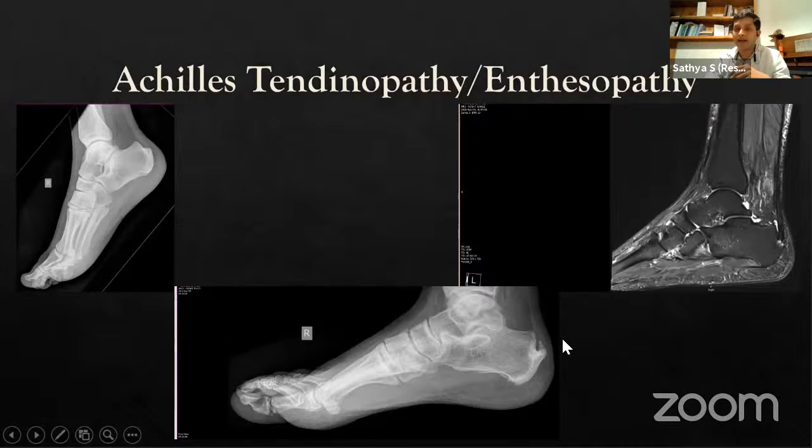However, he had an X-ray taken in January this year, and we are able to see the enthesopathy forming, and the retrocalcaneal bursa was present, and the bursitis was present. Lot of pain. The Achilles tendon was completely inflamed, and we are able to see in the MRI how it is present. You can see the bulge and the swelling. The Kager's fat pad is irritated and inflamed. The posterior ankle is full of swelling, and the retrocalcaneal bursa is inflamed also, which is present here.